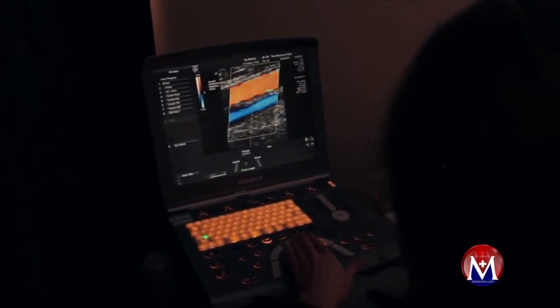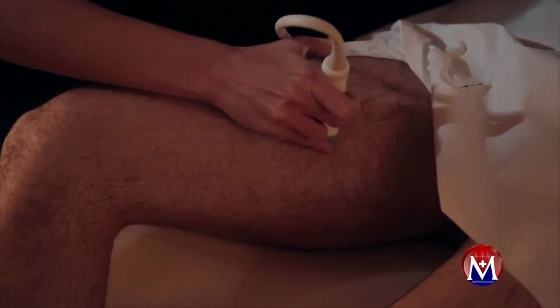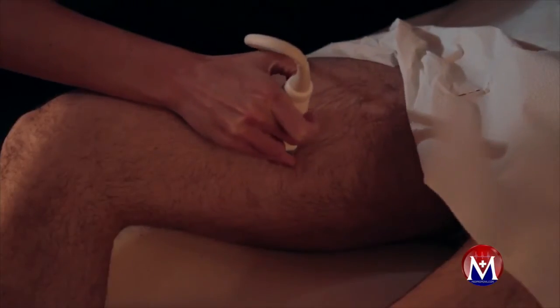Ultrasound gel is placed on the patient's limb and the sonographer will use a compression technique to flatten the veins in order to prove that they are not filled with thrombus.